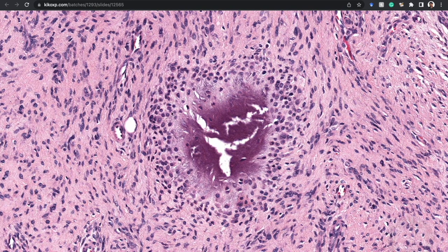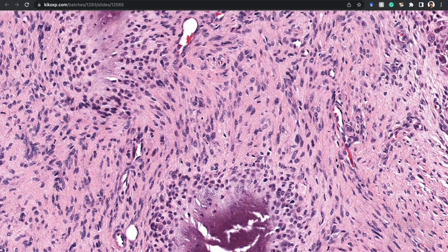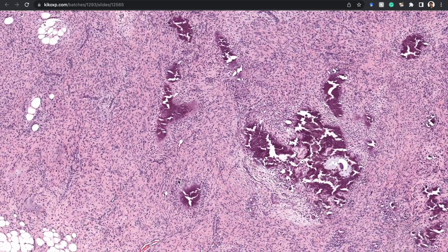Here's a beautiful one — look at the radiating spokes around the wheel. In older patients, particularly older teenagers or adults, when you see a calcifying aponeurotic fibroma it can have much more abundant calcification and also some cartilage component. Because of that, sometimes it gets mistaken for either a chondroid lesion or a calcified lesion, and the background features of the fascicles of spindle cells and the round cells are not always visualized.